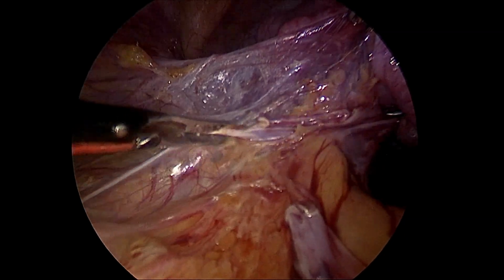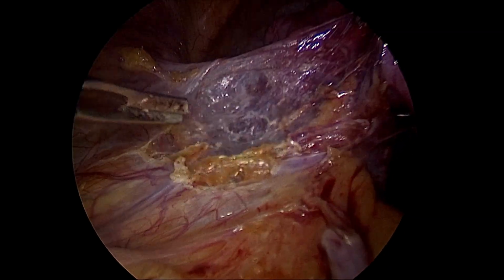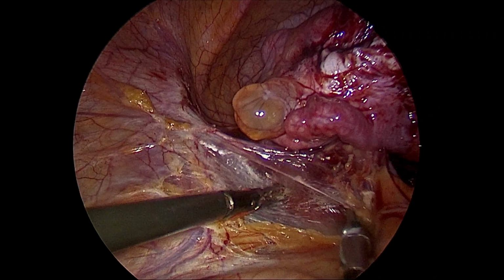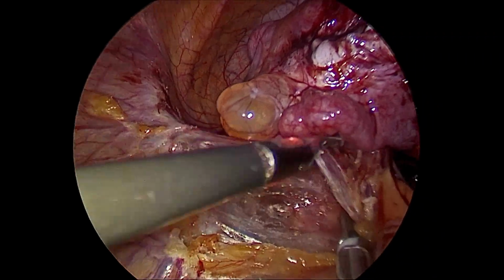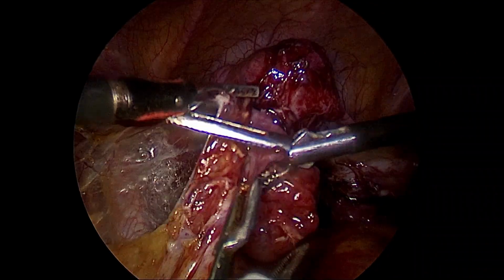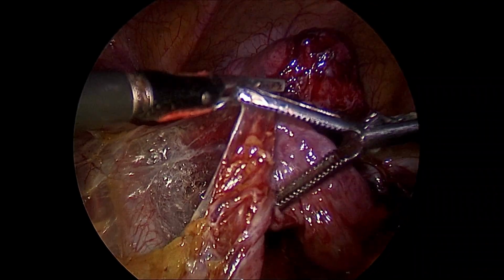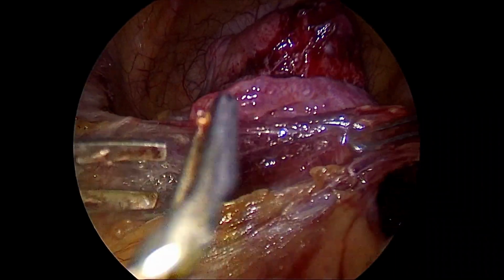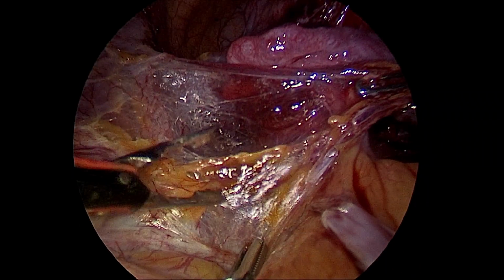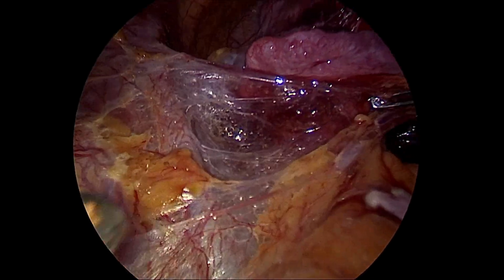Now we go back to the left side where we are trying to dissect the ureter. So lateral pelvic wall dissection starts right near the pelvic brim. In this case I was ably assisted by my general surgeon friend Dr. Hemant Patil, who himself is a very accomplished laparoscopic and general surgeon.